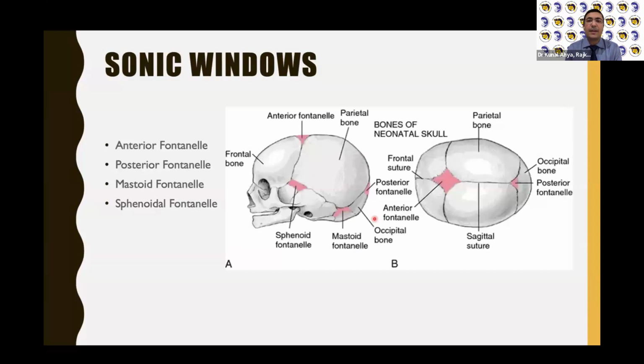So now the practical aspects. This was the theory, when you do it. Now how you do it, how you hold the probe, but now how we actually do the head ultrasound.